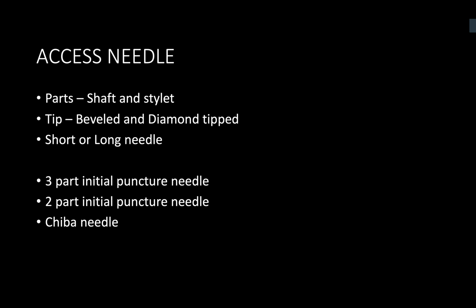So I'm not familiar with this. Okay, so the couple of things that you need to be aware of are, one, the access needle, and the second one is the sheaths, the type of sheath we use, and also different types of PCNL.